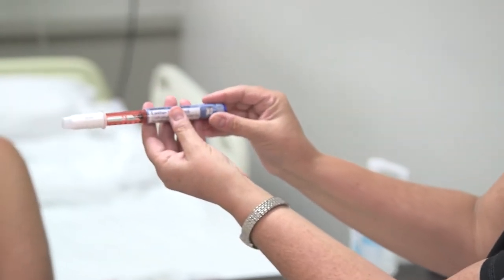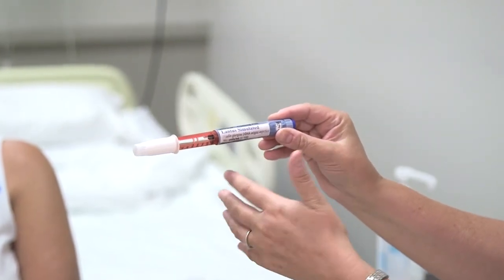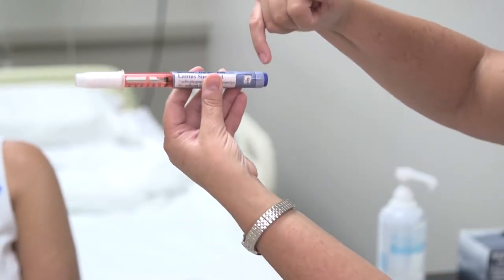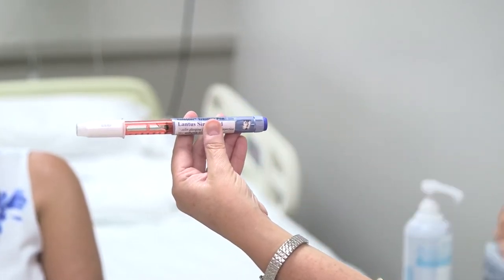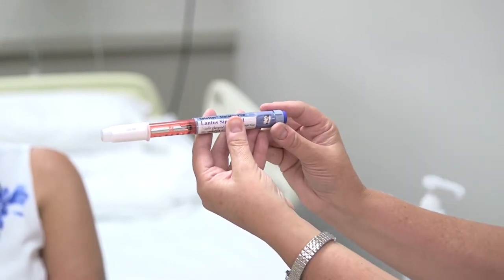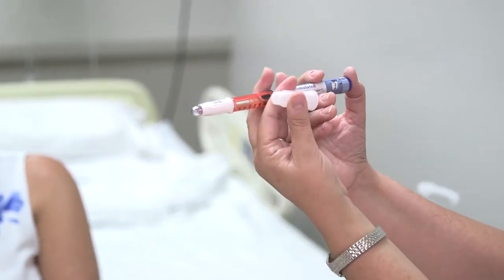The next step is to prime the pen. You always want to prime before setting your dose. Priming is recommended by the manufacturers. The dial is currently on zero, so we're going to turn it to two. We'll prime with two units — this confirms the pen is functioning properly so the patient will actually receive the insulin.